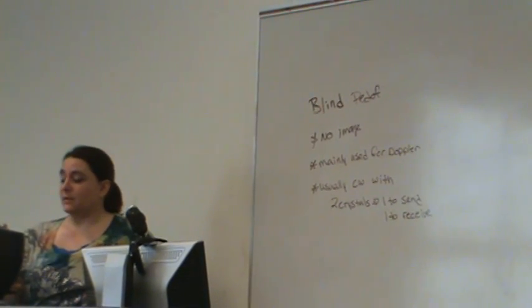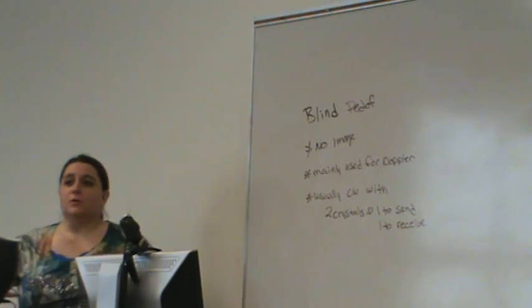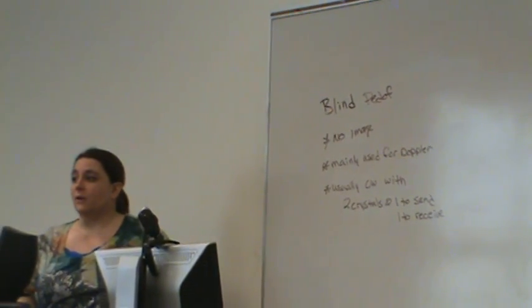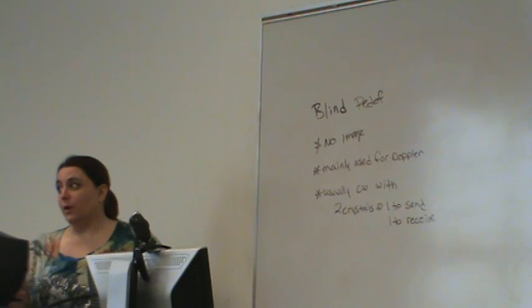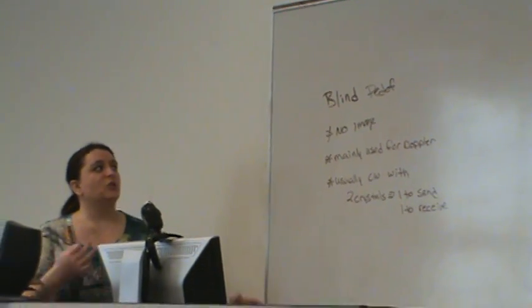So we have to have a second crystal that's receiving. So all CW transducers have that if I'm using just one of these blind CW things. In the general world, you're probably not going to come across these very much. In vascular and cardiac, we use them every day. We have some over in the lab if you ever want to see one. You guys will start to play with them more next quarter. But that's generally what they have.